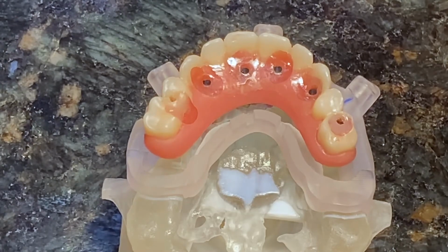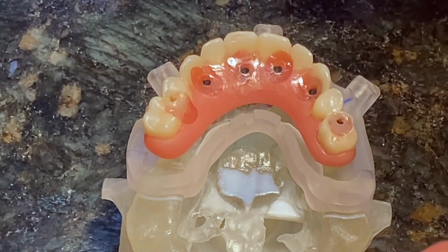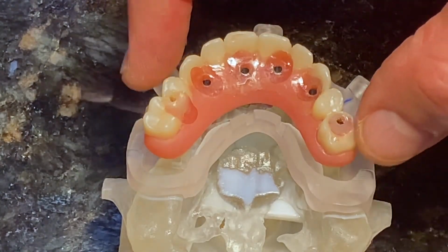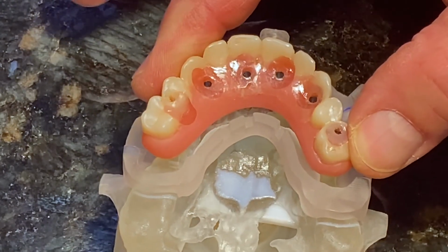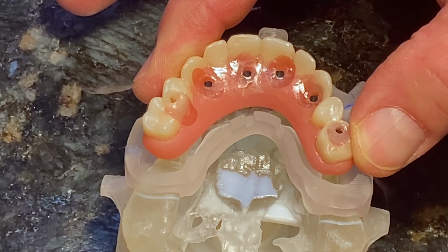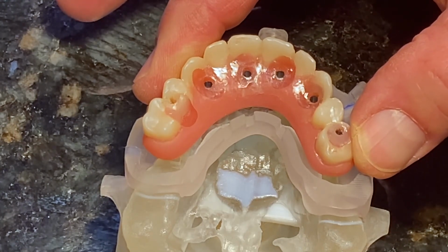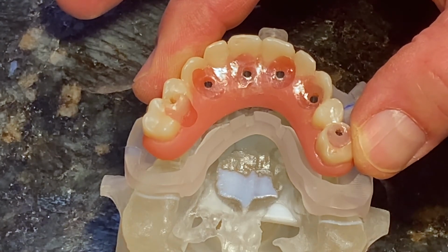It's just phenomenal, and this part of the video shows that, because this was done in the patient's mouth using the guides, and now I can put this back on the model used to fabricate the guides and confirm just how perfect that all ended up being.